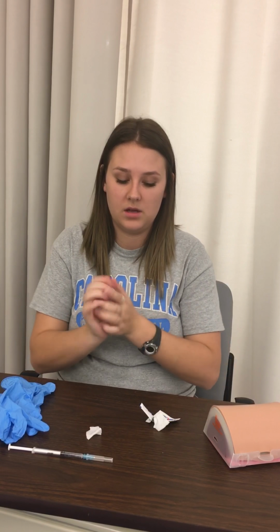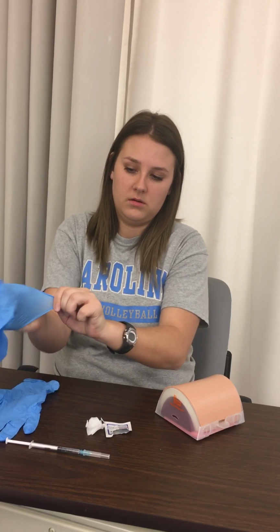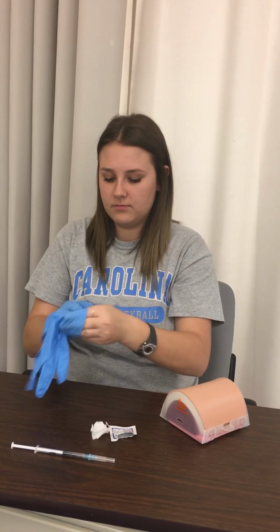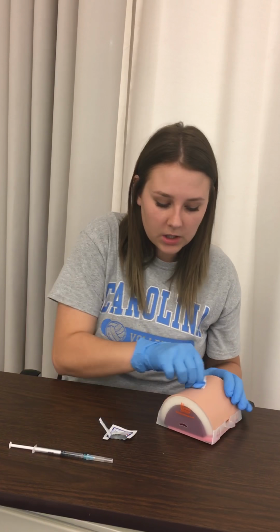Okay? So I'm in the patient's room, and I am going to wash my hands, explain all of that to them. Whenever you are doing this, we're going to say this is the back of their arm. You're going to clean it with an alcohol pad. Clean the area. You're going to let that dry because you don't want it to sting. Okay, you're going to put your gloves on. Alright, clean the area really good.